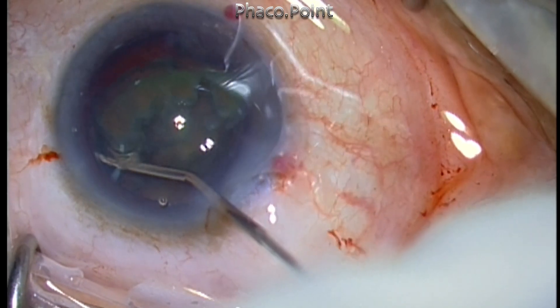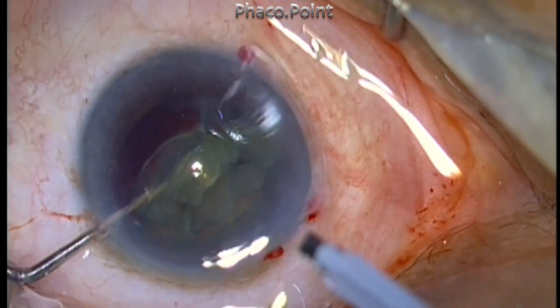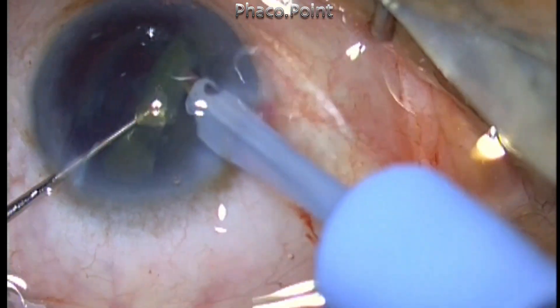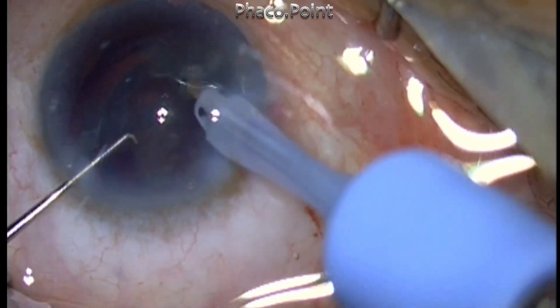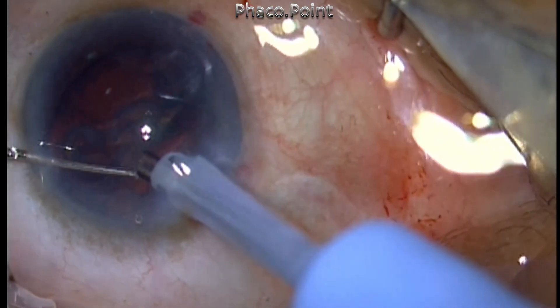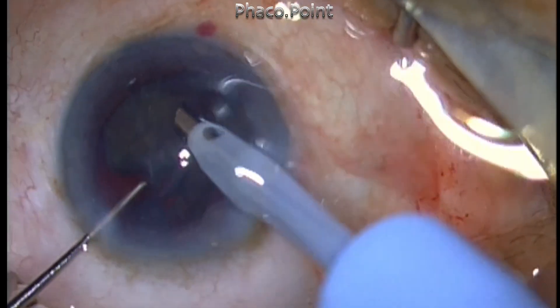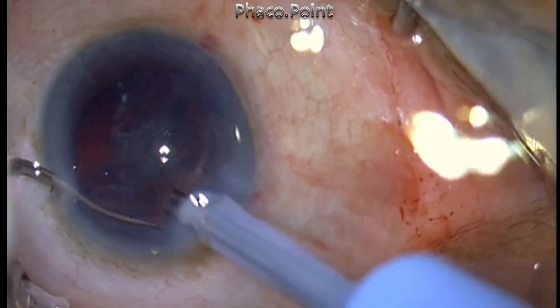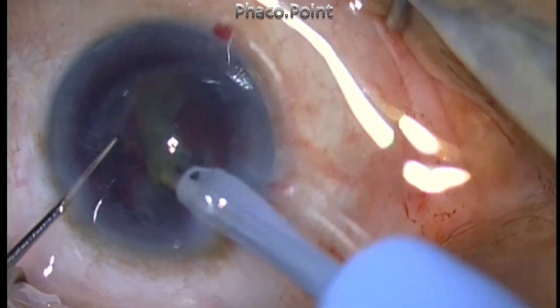Once the nucleus is tilted up and lifted out of the capsular bag, then it becomes child's play to handle this lens, and immediately the tension is diffused and the management continues along predictable lines. You can use fluid also — hydro dissection — to elevate and lift the lens out of the capsular bag. But a viscoelastic substance like hydroxypropyl methylcellulose, having a much higher viscosity, is more likely to do the job and lift up even a thick plate of soft cataract. So you're more likely to succeed in creating the elevation and lift of the nucleus out of the capsular bag if you use a viscoelastic rather than just simple fluid.